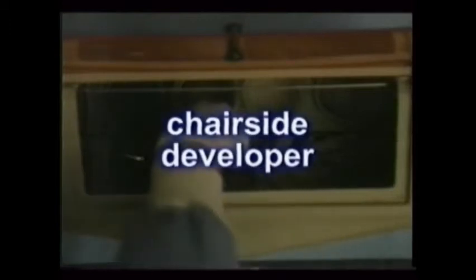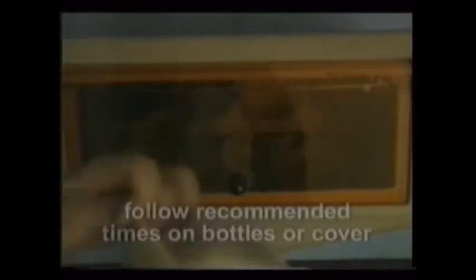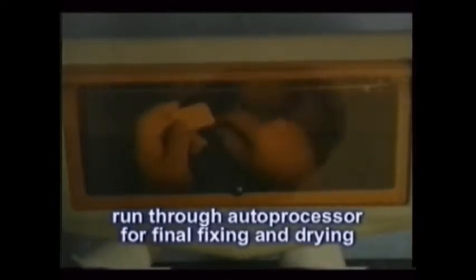The chairside developer is a great tool that allows quick availability of a readable film. Used extensively in endodontics or root canal therapies, it's also helpful when treating emergency patients by minimizing the time needed in diagnosis. Depending on the chemical temperatures, follow the developing and fixing times marked on the bottles. When finished, run these quick-developed films through the automatic processor or the manual fixing process to permanently protect them from turning brown.